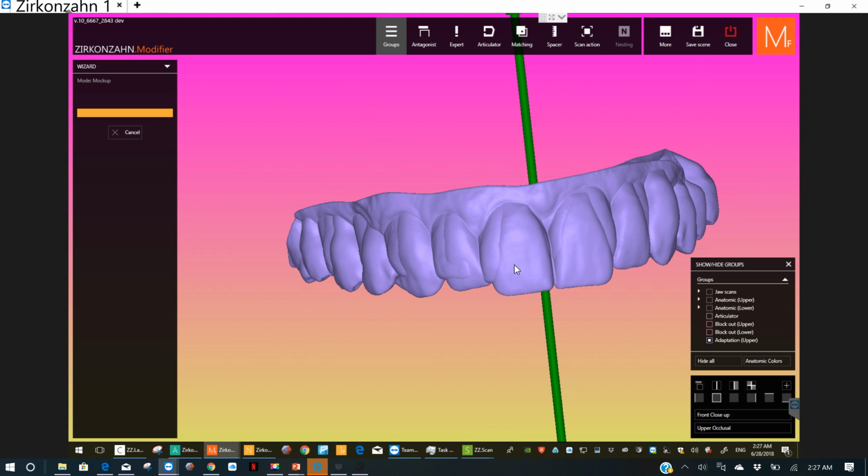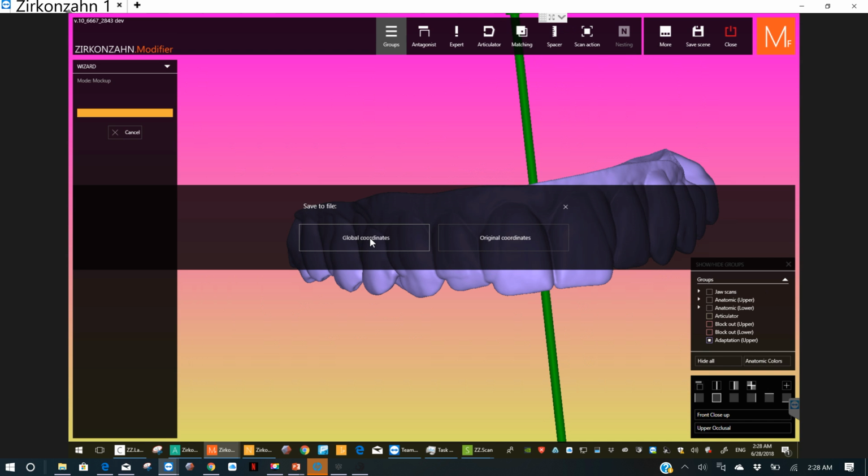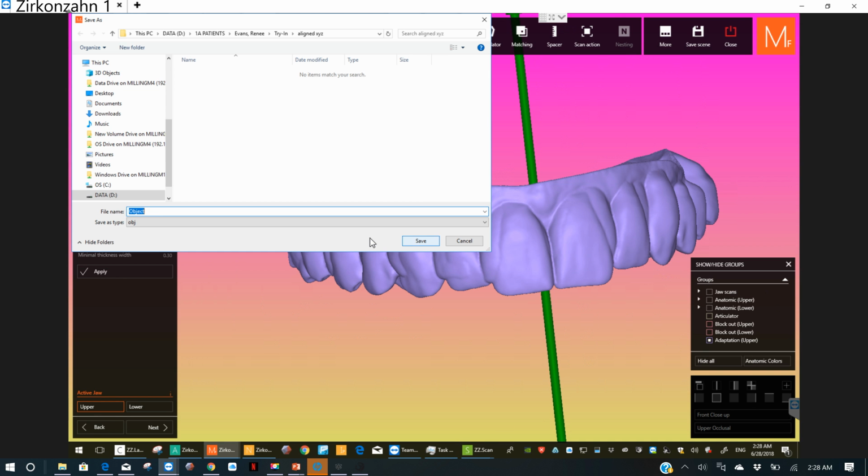Now here's how you save it. So right click on it and go save to file. You want to save your global. I like to call this mockup snap-on upper, and make sure you change it to STL. And make sure it's in their file.